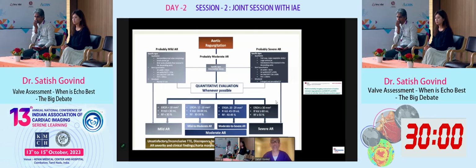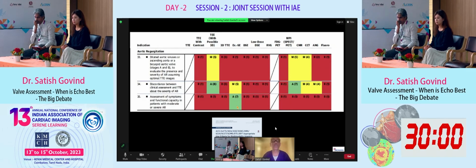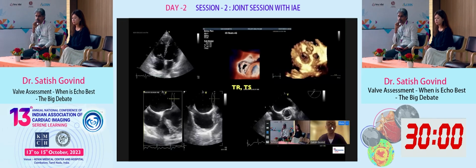And we look at whether the information is accurate or not accurate, then we move on to TEE. Again, there is a limited role as far as TTE is concerned, but when it comes to 3D TEE, it is helpful here. And exercise stress echo can be used to look at discordance, when the clinical assessment is saying something and the TTE is showing something else.